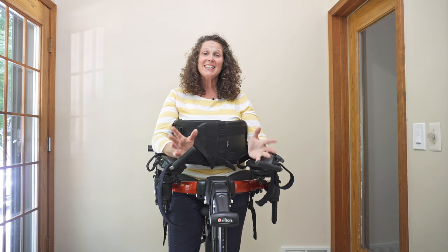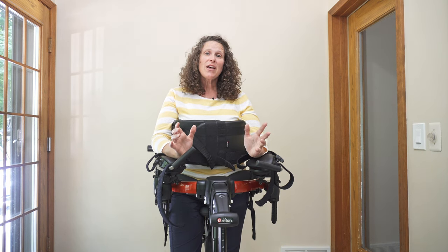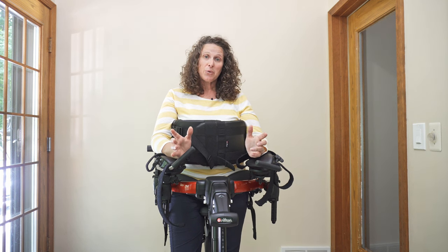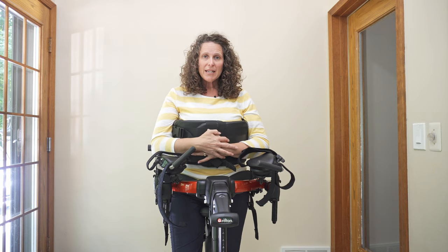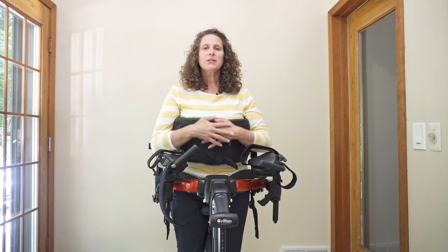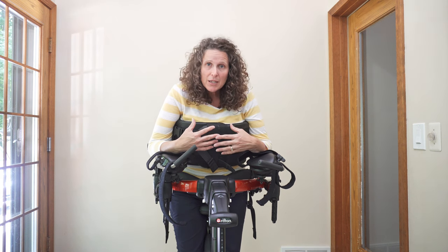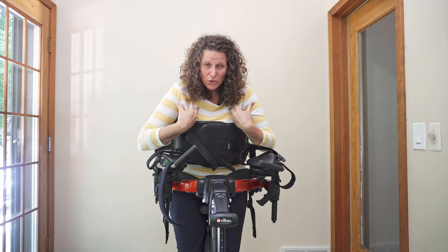The first thing I want you to do is actually get into a pacer yourself, so that you can feel what these adjustments might look like and feel like for the individual that you're working with. Once you get into a pacer yourself, I'd like you to feel what it's like to be in a position where your shoulders are forward and your head is down.